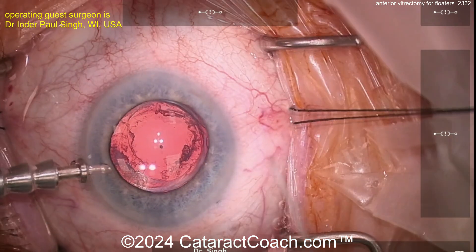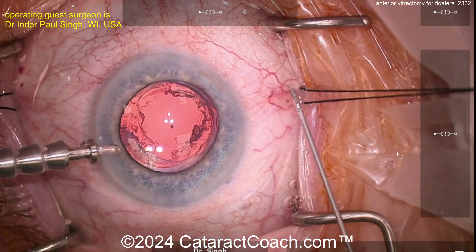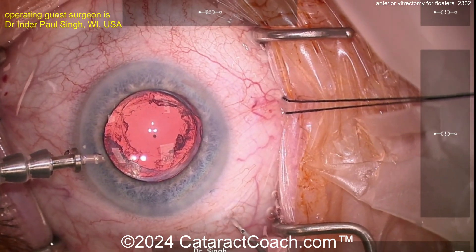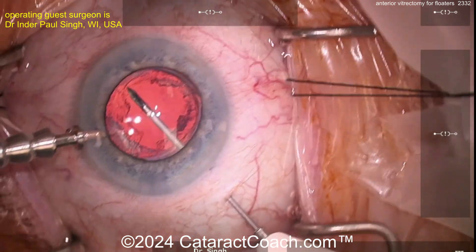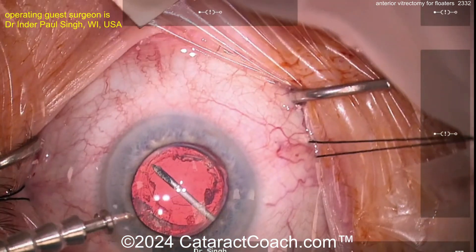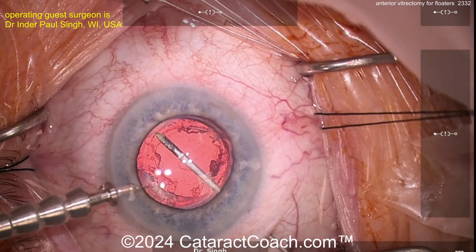Measuring about three and a half millimeters. I'm taking the one-step 27-gauge needle with the vitrector — you can see the bevel up. I'm going to enter with conviction. You'll see a little resistance; tell the patient to expect some resistance. Aiming towards the middle of the eye and then angling up, so I'm underneath the lens, now in the middle of the eye where I can see the tip of the vitrector.